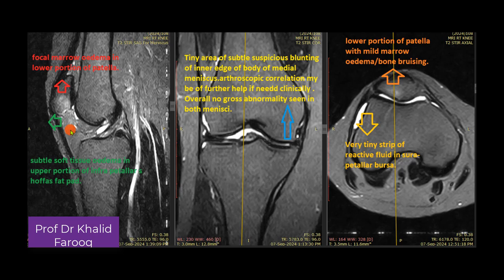On axial images, we can see a very tiny strip of fluid in the suprapatellar bursa, and mild marrow edema is also identified on axial images. These changes are due to repeated microtrauma injury leading to bone bruising and impingement of Hoffa's fat pad, which is the cause of pain in the anterior joint compartment.